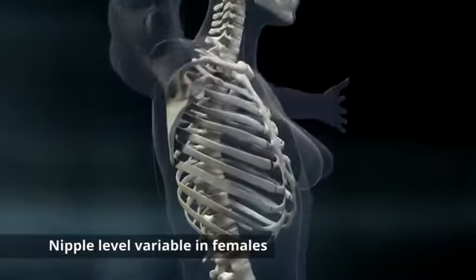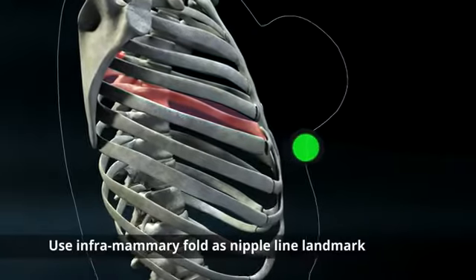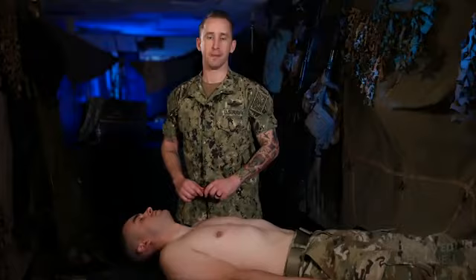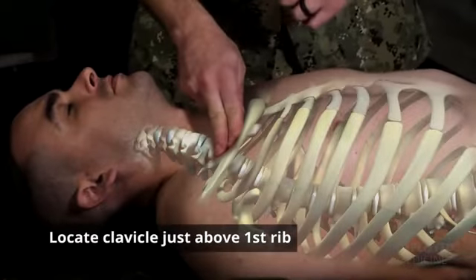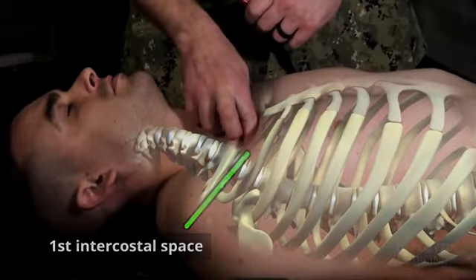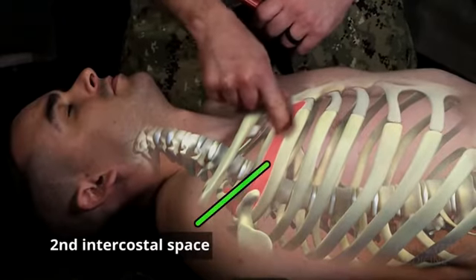The nipple level is variable in females, but you can lift the breast and use the level of the inframammary fold. I'm going to demonstrate on the second intercostal space, midclavicular line. I want to locate my patient's clavicle, which is also right above the first rib. Underneath that is the first intercostal space. Moving down, I find the patient's second rib. Underneath that is the second intercostal space.